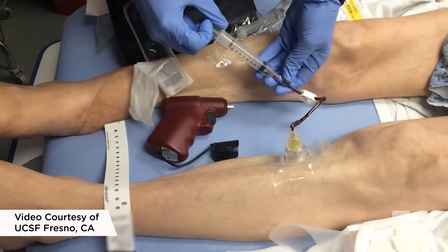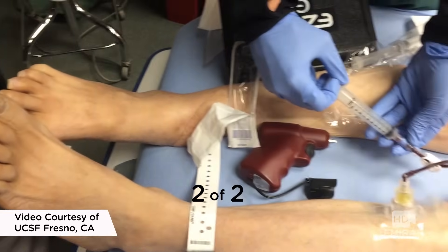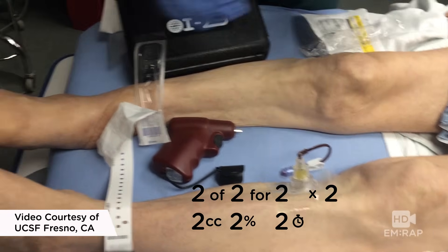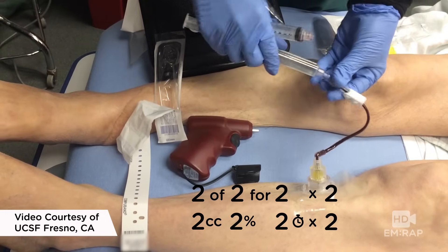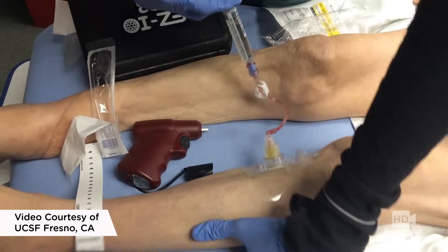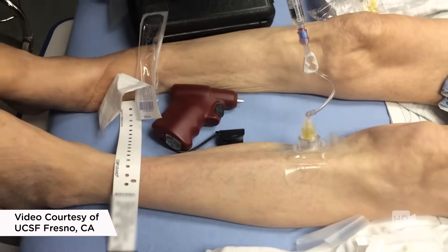Now, if you're going to do this in an awake patient, I recommend using some anesthesia. You can use my mnemonic: two of two for two times two. That's two cc's of 2% lidocaine over two minutes, then do a flush and wait, and then repeat it — so times two. Two of two for two times two. That gives your patient 80 milligrams of lidocaine. Some people use a little more, a little less, but that's a safe amount. I also recommend anesthetizing the skin and periosteum before you start.